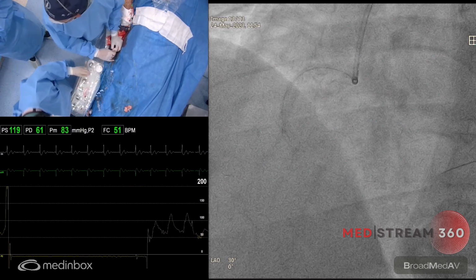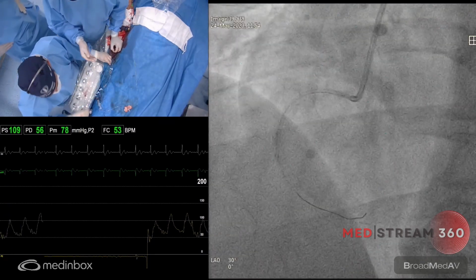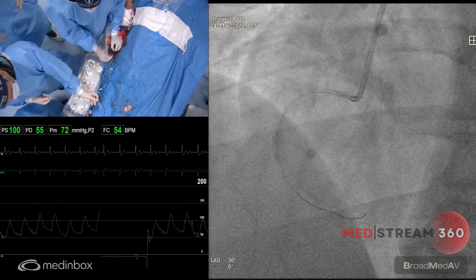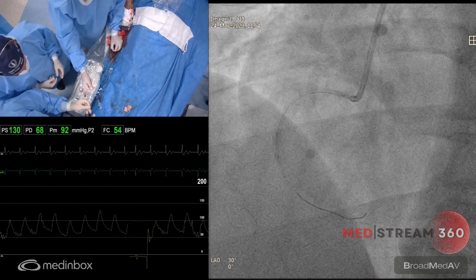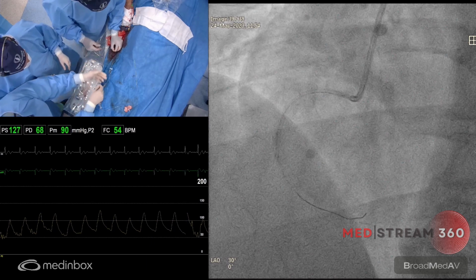It's necessary to know the technologies. Yeah, the details are very important to see. And have the material. With calcification, yes, we need to have everything in here. You need to have the tools close to you. Tips and tricks, and the tools.